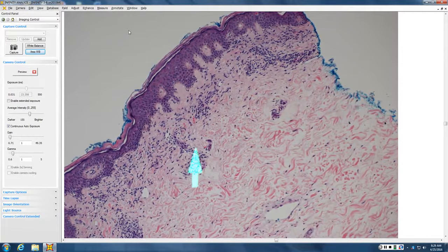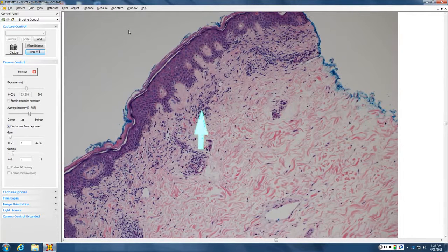It sounds like Forrest Gump. That's about it. Can GVHD look like this at all? No. GVHD is sites of damage out of proportion to lymphs. This one, you see bundled collagen above the postcapillary venule. That counts as papillary dermal fibrosis. That puts you strongly towards MF. So a lymph in every hole pattern with papillary dermal fibrosis is MF till proven otherwise.